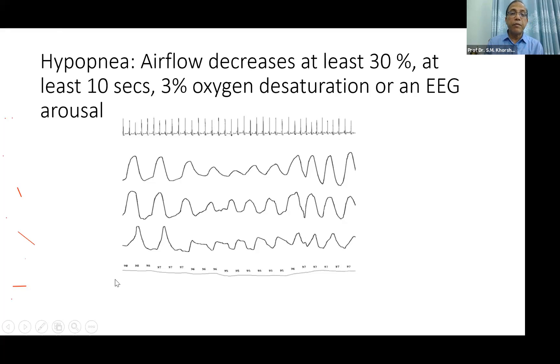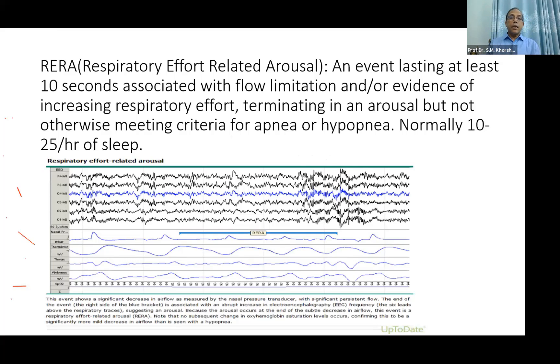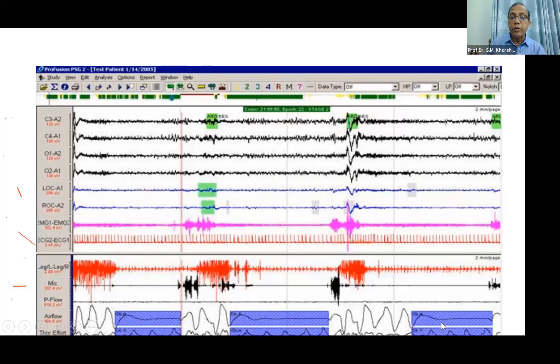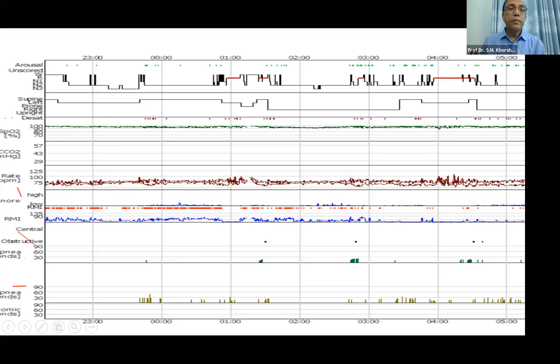In hypoapnea, there is minimal thoracic effort and minimal abdominal effort, but the oxygen saturation curve is going down. When looking at the graph and subsequent graphs, we have to look carefully to find these things. The simplified approach is to follow the airflow — look for absence of airflow, presence of abdominal effort, and respiratory effort. These are the phases to identify, along with muscular movements.